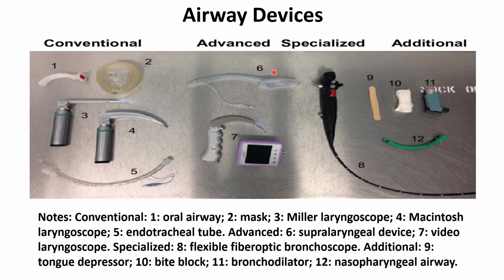Classic laryngeal mask or second generation laryngeal mask, video laryngoscopy, C-MAC, flexible fiber optic bronchoscopy, and additional devices for advanced airway if you are suspecting this patient of difficult intubation, using the difficult intubation algorithm and Mallampati score.